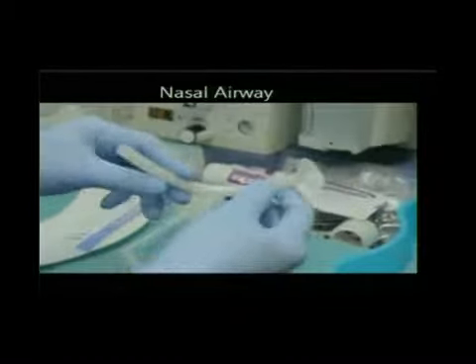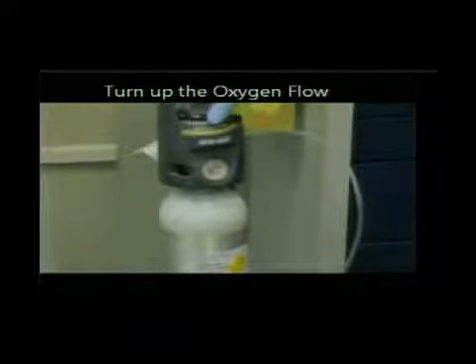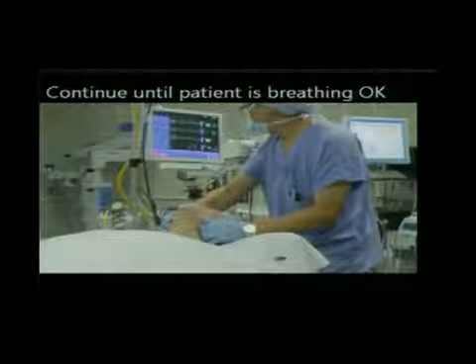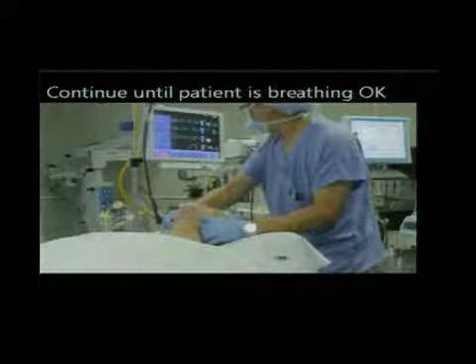If you need to, you can put in this oral airway or this nasal airway. If those fail, then you put in something to move the tongue out of the way, and you turn up the oxygen so the patient is receiving additional oxygen as well. Okay, now, stop. You keep doing this until the patient starts to breathe. You don't just do it once, because you're responsible for seeing that air is constantly moving in and out of the patient's lungs. So you do this until you verify that the breathing is okay.